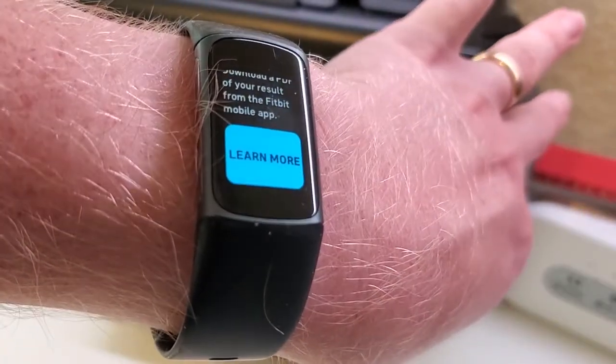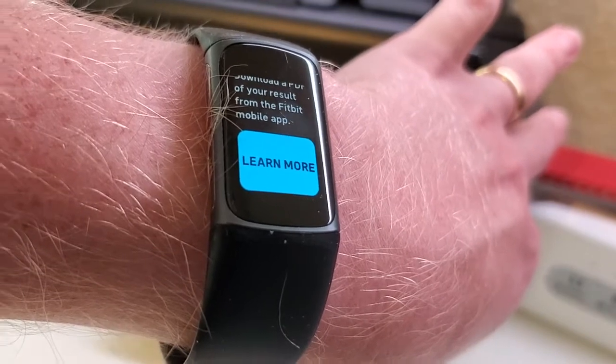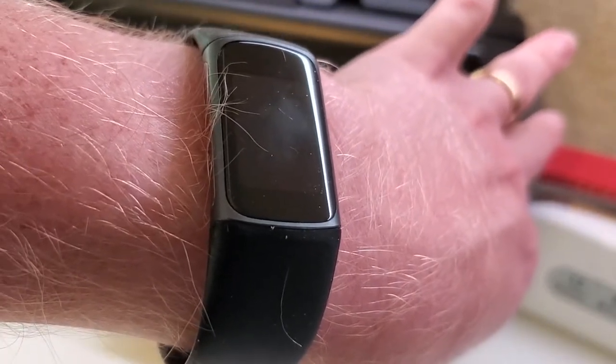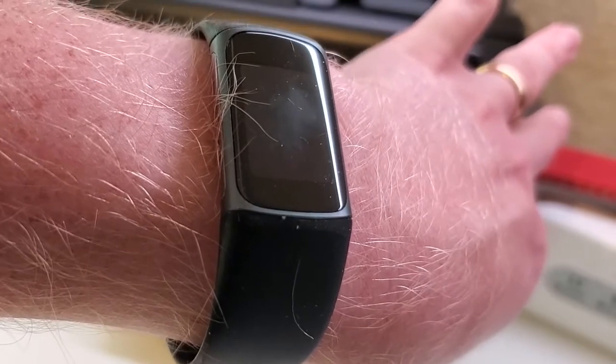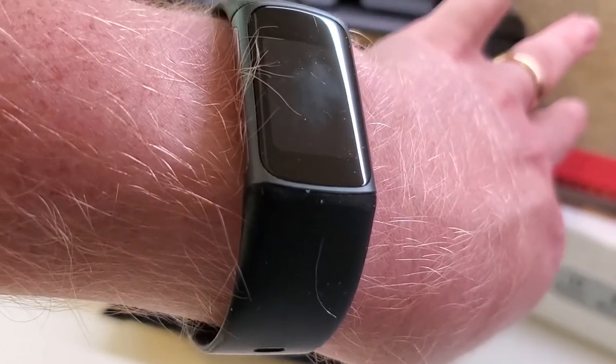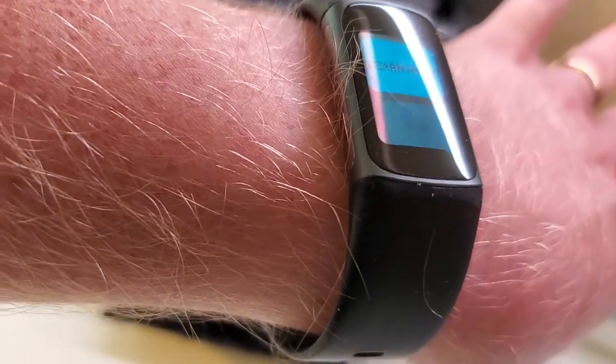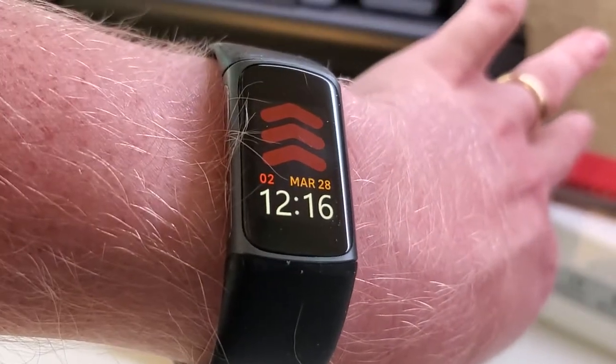One final thing that's nice is that you can actually get a report on your results in the Fitbit app. It's a PDF you can share with your doctor that actually has a trace of that ECG, and they can look at that and use their own expertise to evaluate it. So it's nice to have that because you get the analysis on the watch, but then you can actually send that right along to your doctor.